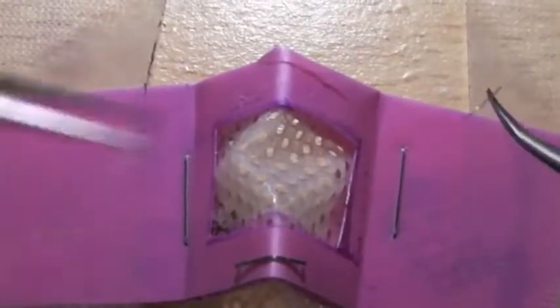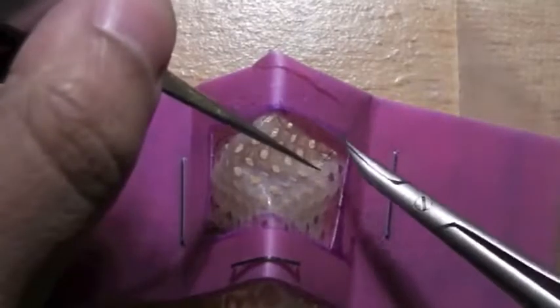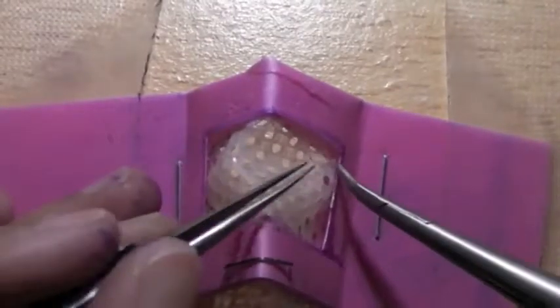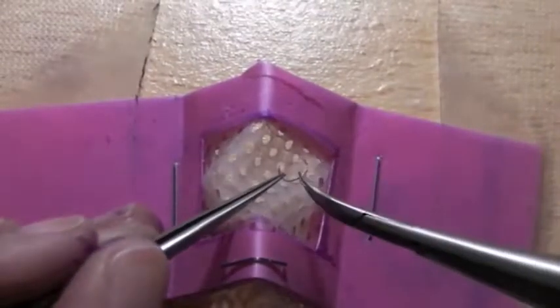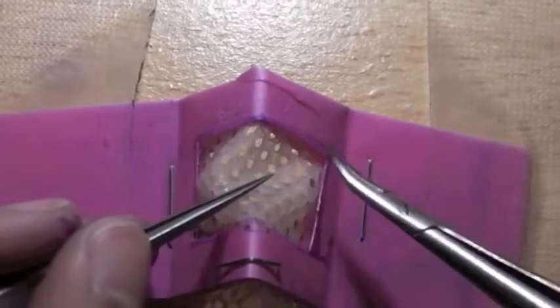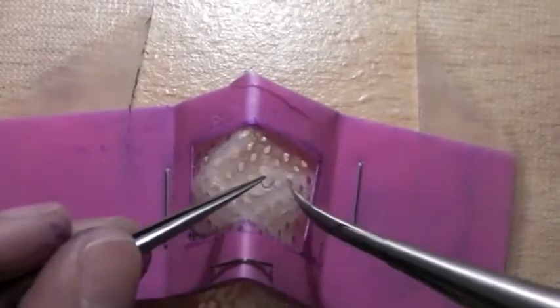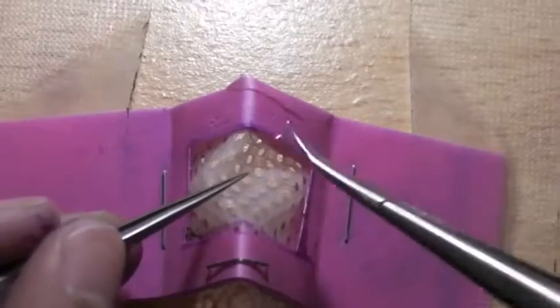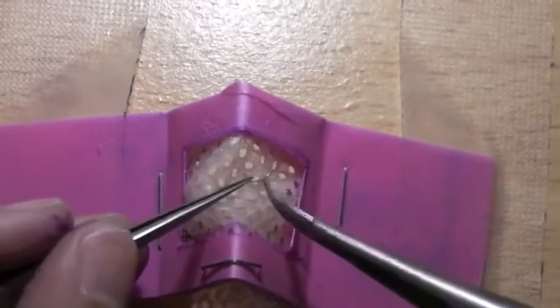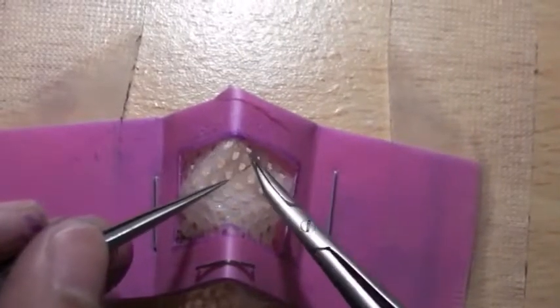Start off forehand, going from right to left. The perforations go diagonally — remember to follow the curve of the needle and try not to grab the tip.